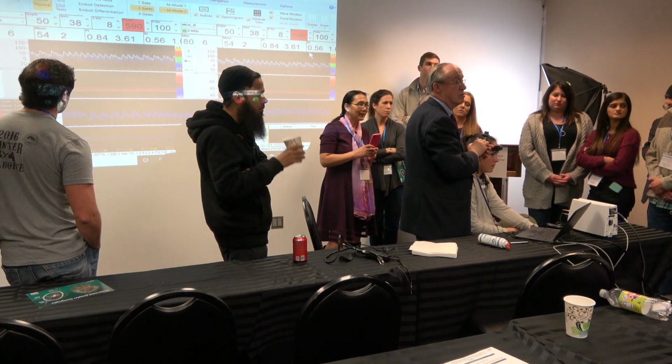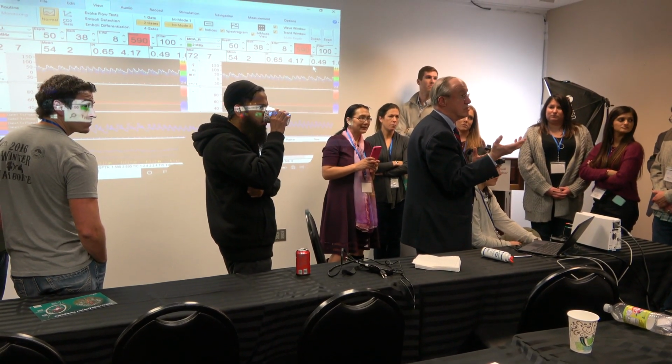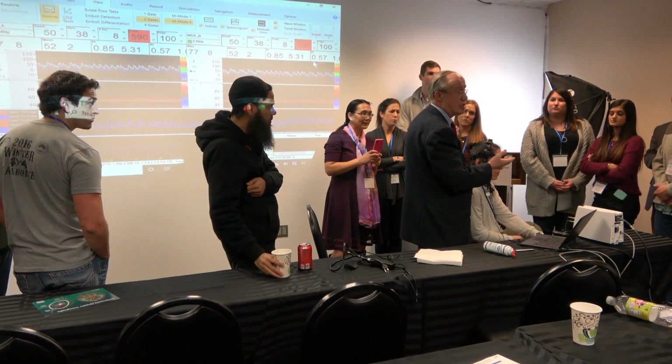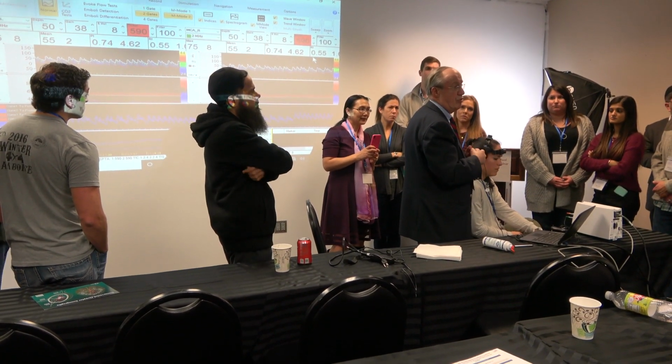In surgery, do they do both sides and everything? It depends. For carotid endarterectomy, you need only the side of intervention. For CABG, better to do both, right?